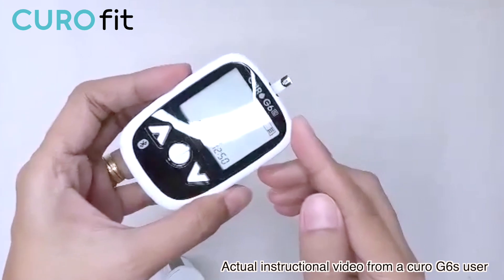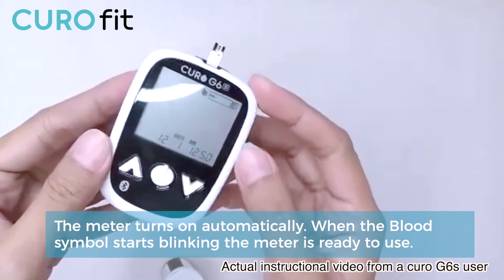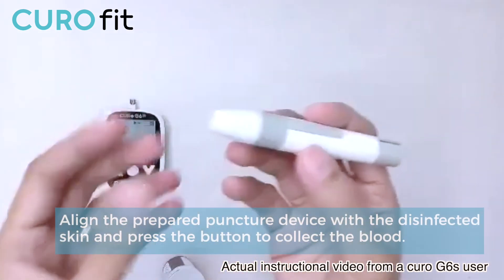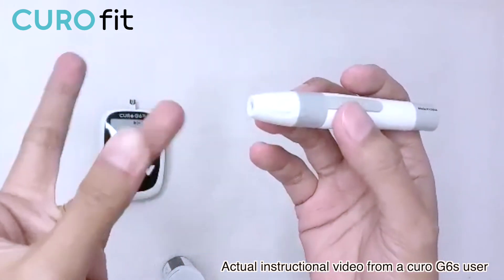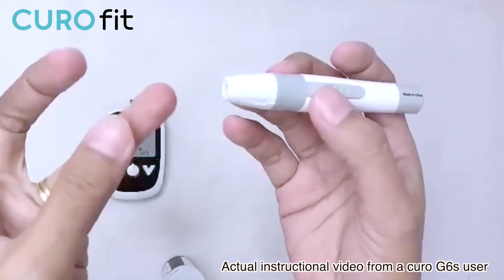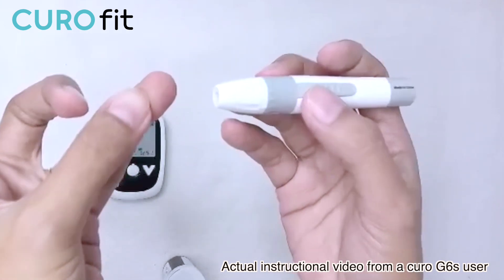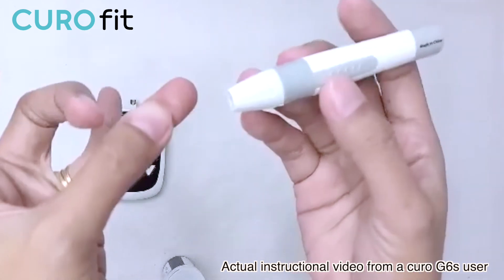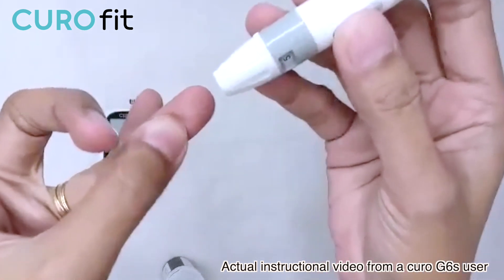A flashing test strip will appear at the top of the screen, indicating the meter is ready for testing. Now I'm ready to prick my finger. Let me massage my finger first. It is important to understand that the Curo G6s test meter only requires 0.5 µL blood sample volume. To get the exact amount of blood, I need to turn the device upside down. Let me just prick my finger first.